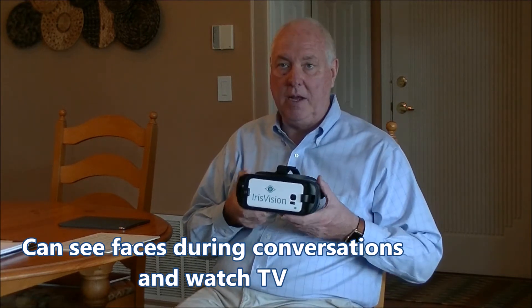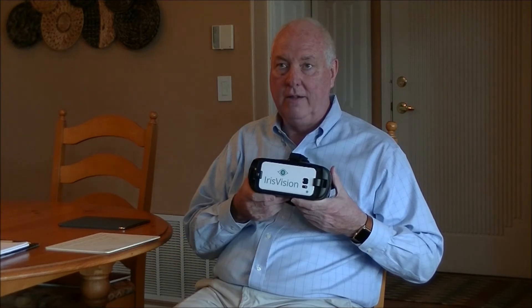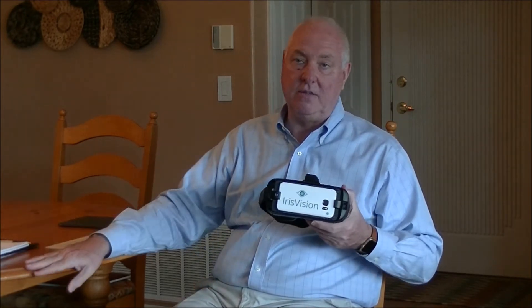Many people want to be able to watch television, and the Iris Vision works really well for TV. I've experimented with different televisions, different distances, and different sizes of TVs, and there is quite a bit of variation.